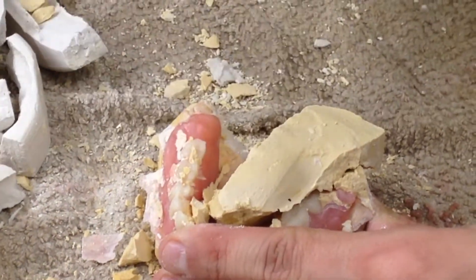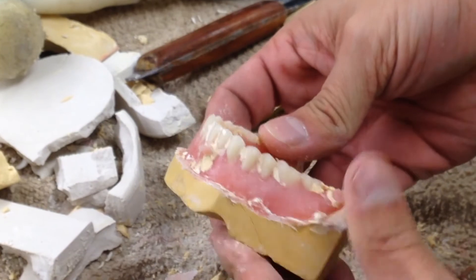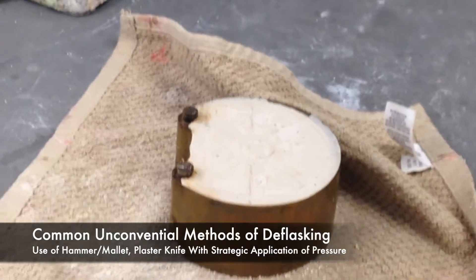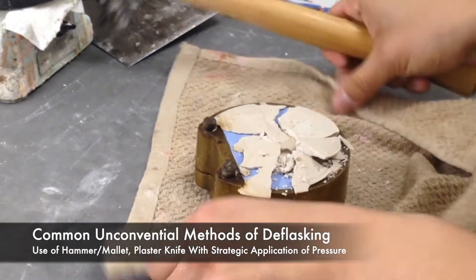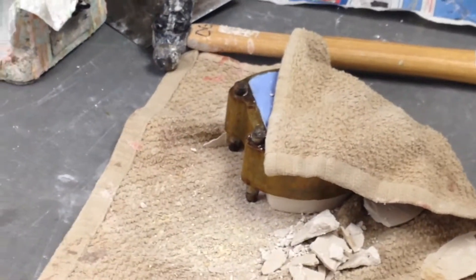The techniques used in this video for mandibular de-flasking are closely aligned to that of the Air Force Manual. In the absence of equipment and tools, some common unconventional methods can be used to deflask. Many technicians within the industry will make use of a hammer or rubber mallet and a plaster knife in order to deflask.